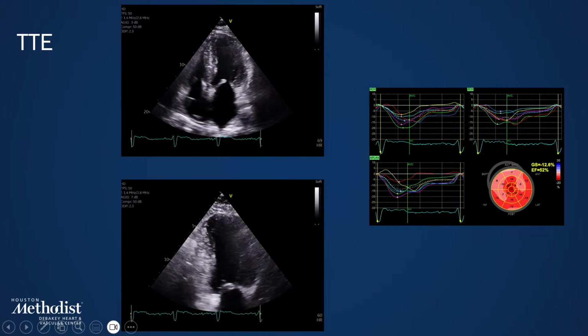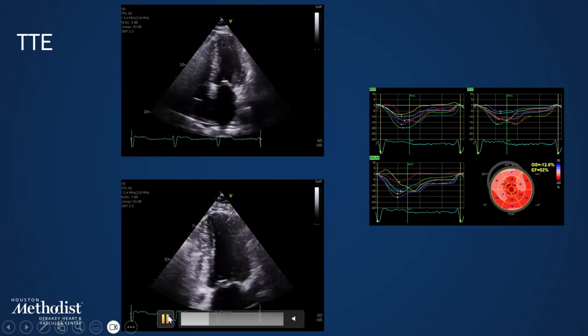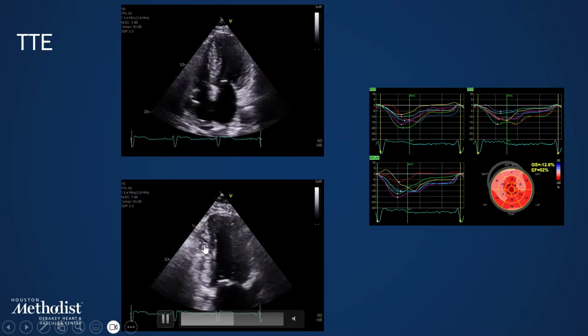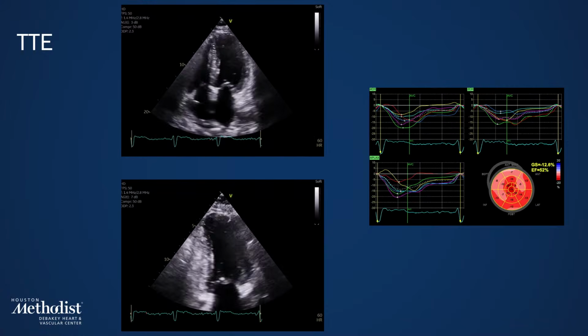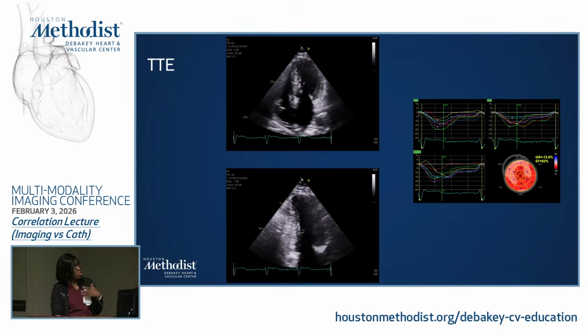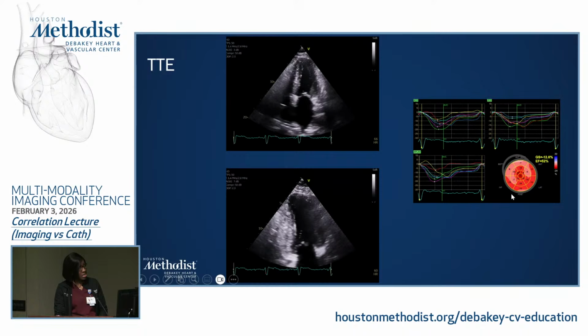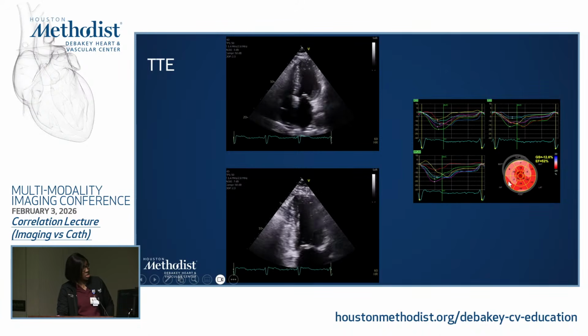On arrival, he had his echocardiogram with us, and this basically showed normal LV size and volumes, some element of akinesia in the basal to mid septal segments, and a globally hypokinetic ventricle, but no obvious etiologies to his presentation as seen on this echo. His ejection fraction is about 52%, and we can see a globally reduced strain with some territoriality to it, where we have a much more reduced strain in the anterior and septal walls.